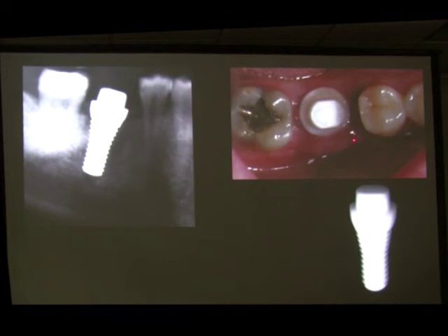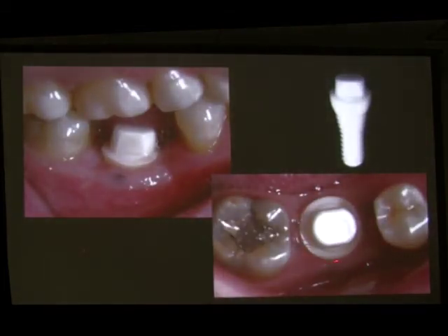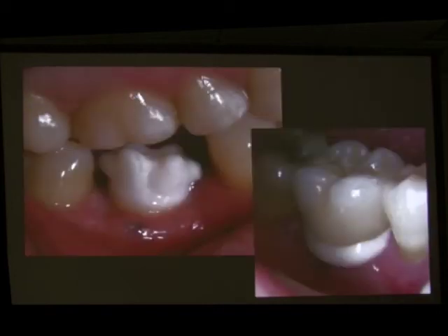And 15 days post-op, the patient comes with gum completely not mobile, but it's not mature. But I want to remind you that this gum was all the way here, and we did not do a punch. If we do a punch, we would have the crest going to the lingual as it was before. And just by doing this without bone graft, you will see what a huge difference it makes on the emergence profile of the tooth. So look at the amount of keratinized tissue now that we have 4 months post-op. The implant is completely supragingival.